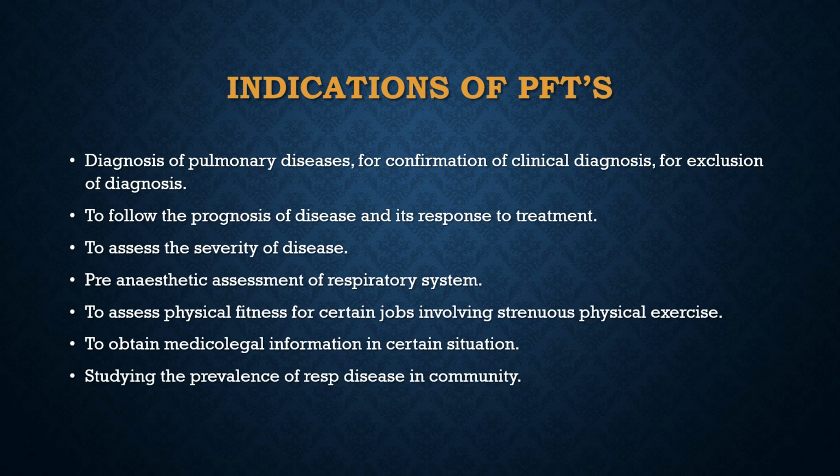So we'll see the indications of pulmonary function test. Diagnosis of pulmonary diseases, for confirmation of clinical diagnosis and for exclusion of the diagnosis. To follow the prognosis of disease and its response to treatment. To assess the severity of disease, and it is used as a pre-anesthetic assessment of the respiratory system.